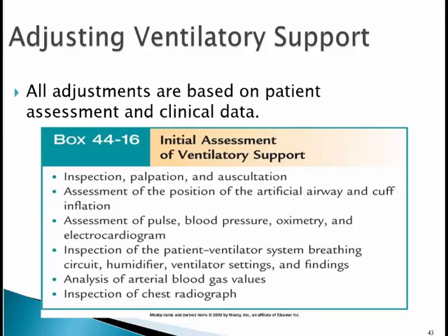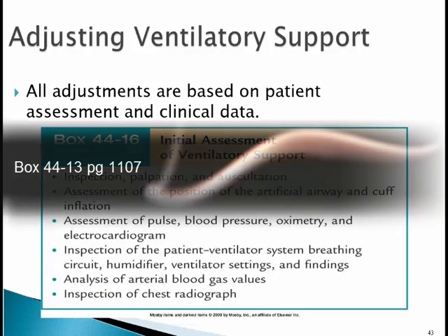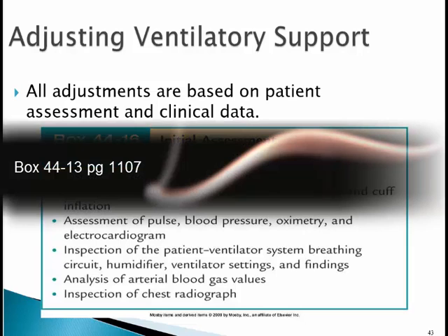If you take over care like in the ICU, then once you receive your report, it's your patient and you need to do the initial assessment. Or if it's patients coming from surgery, or if they're just being intubated, initial assessment is still called for. And so this is box 44-13 on page 1107.